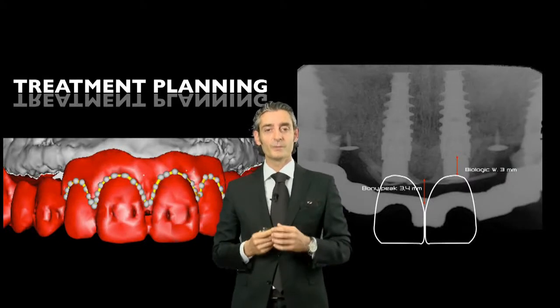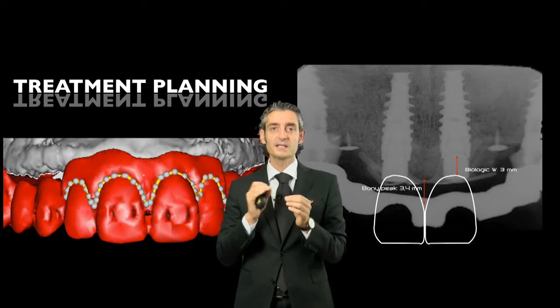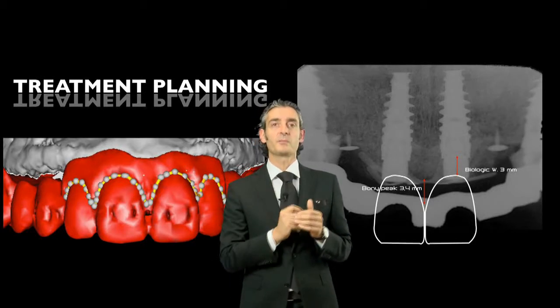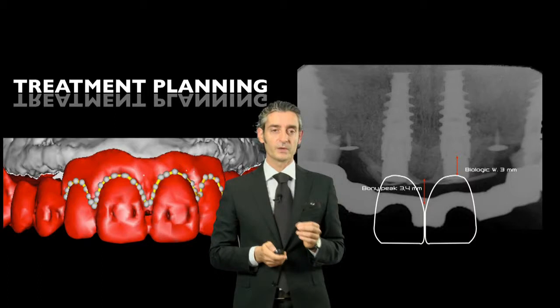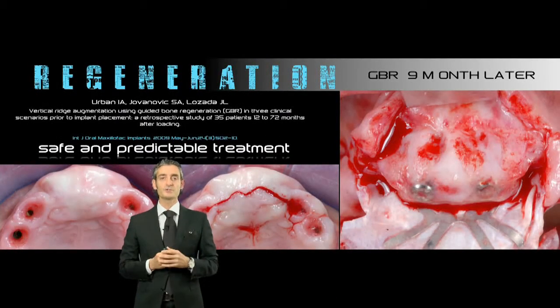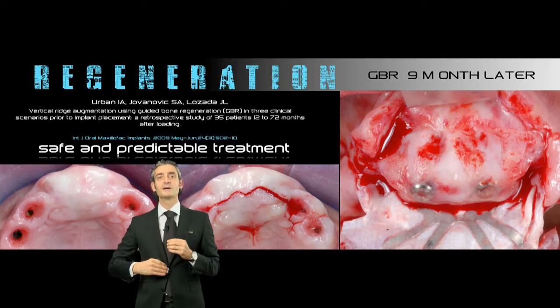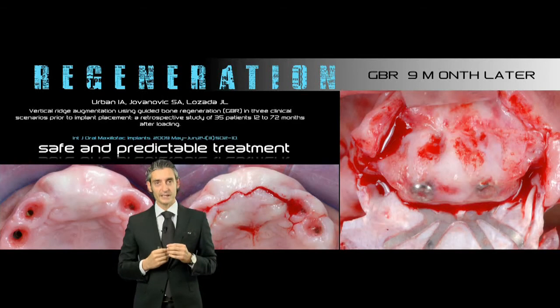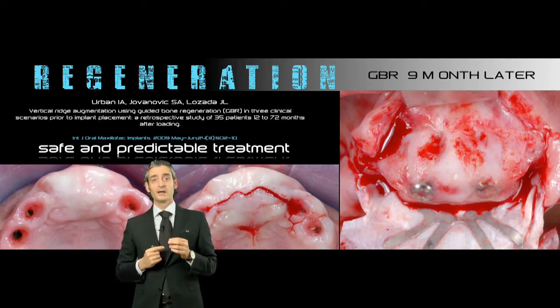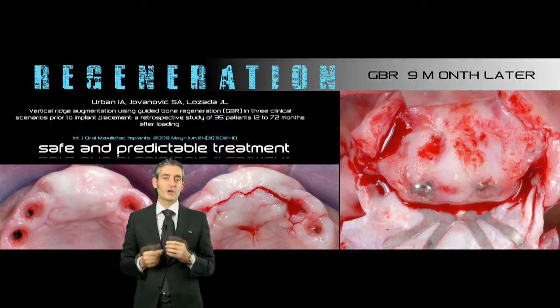And I think that this is a good example of how to place our implant, considering starting from a precise starting point. Okay. And after 9 months, this was the result. It was a great result. So we were able to obtain a lot of bone up to the healing abutment. So we were almost 5 millimeters away from the previous level of the bone, so 1 millimeter more, but we have to consider some contraction as well.